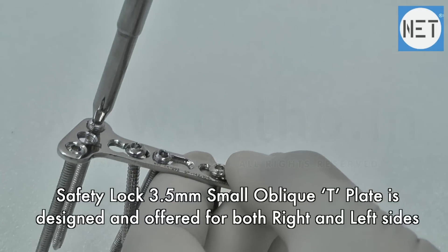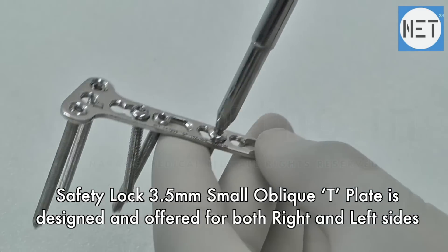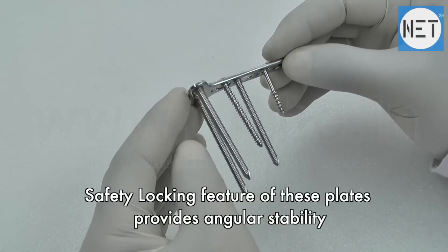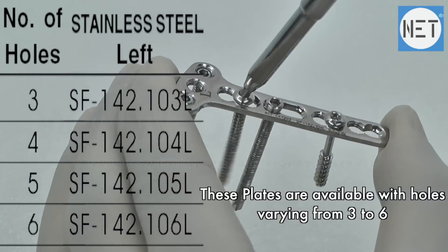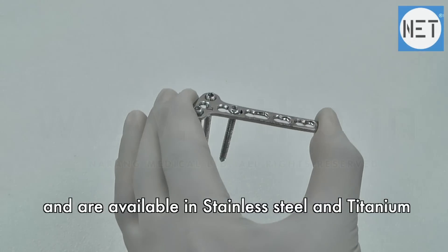The Safety Lock Small Oblique T-Plate is designed and offered for both right and left sides. The safety locking feature provides angular stability. These plates are available with a number of holes varying from 3 to 6, and are available in stainless steel and titanium.